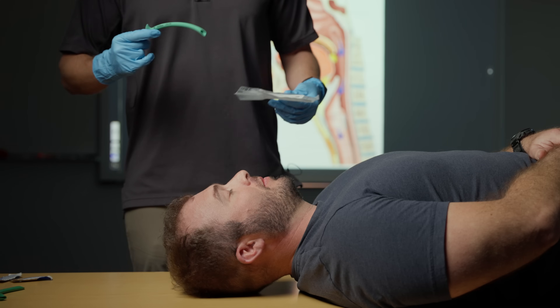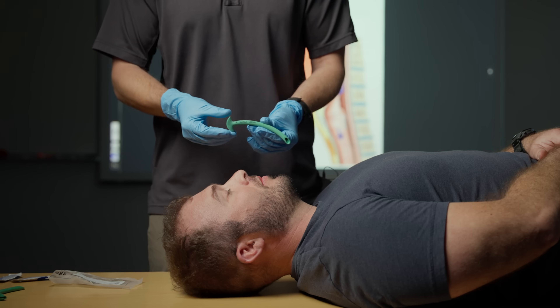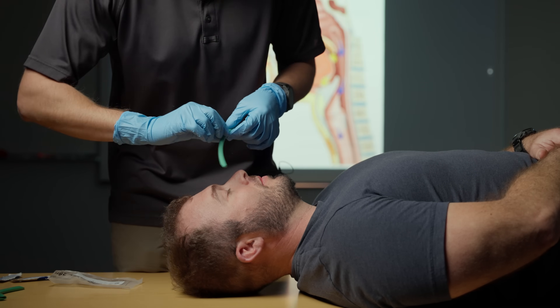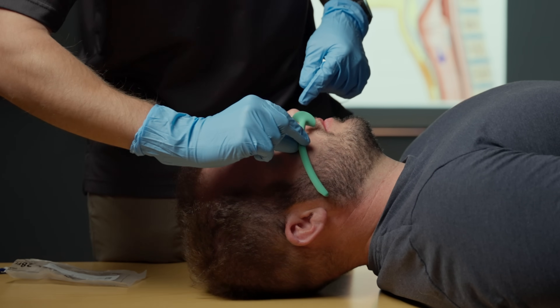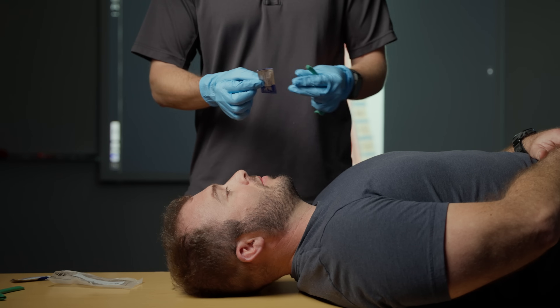One of the first things we want to do is measure this NPA to make sure we have the right size. I have a 28 French NPA, and I know this is the correct size. We're going to measure it right between the earlobe and the base of the nose — maybe slightly small, but if I go a size up it's going to be too big. Visualizing the nostril and this tube, I can tell they're about the same size. We want that bevel facing the septum when we put it in, so we're going to put it in Brian's right nostril. We have the medical lubricant.